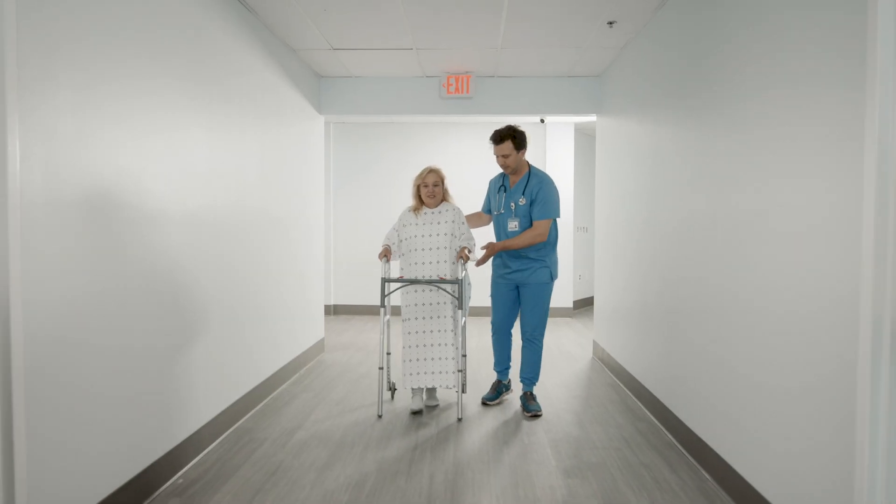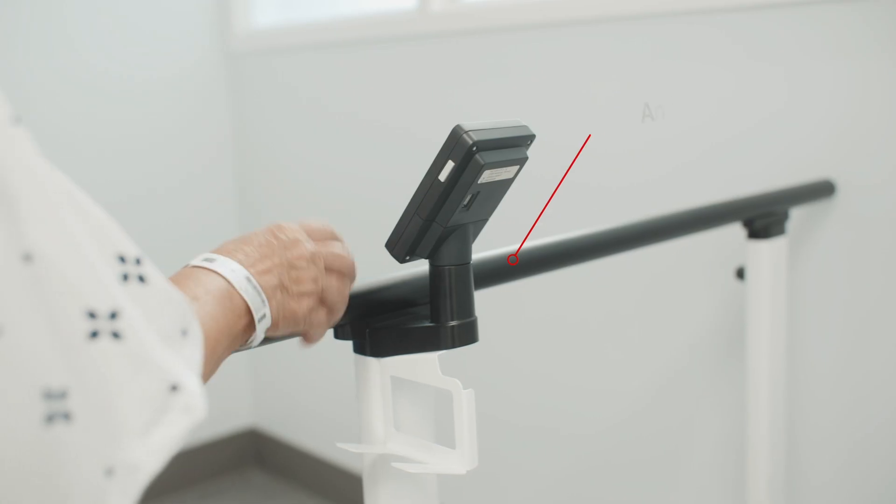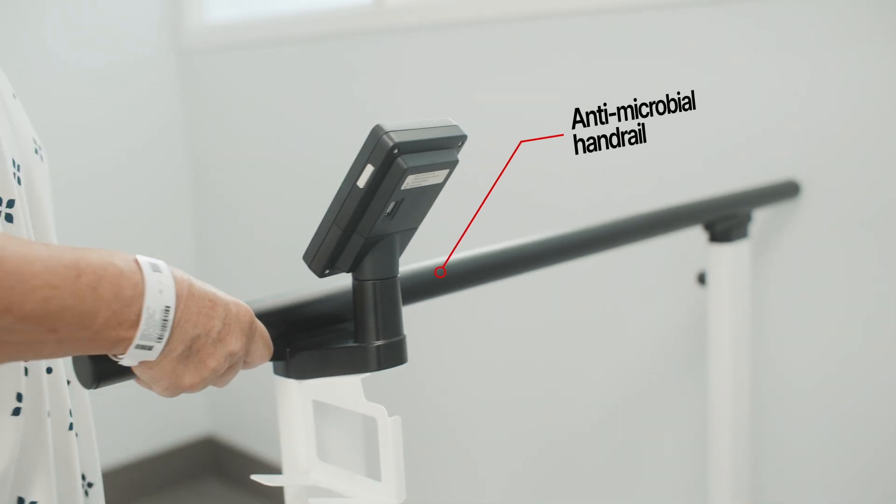Even in post-op situations, the X-Line is your trusted sidekick. It allows for easy stepping on and provides stability during the weighing process.